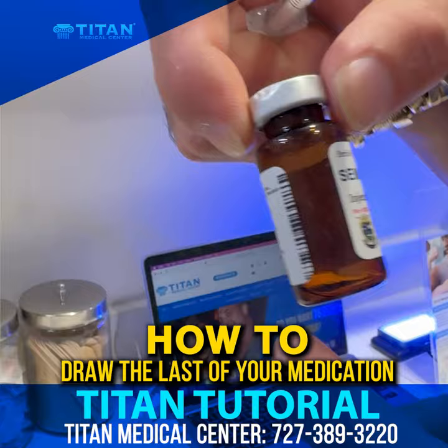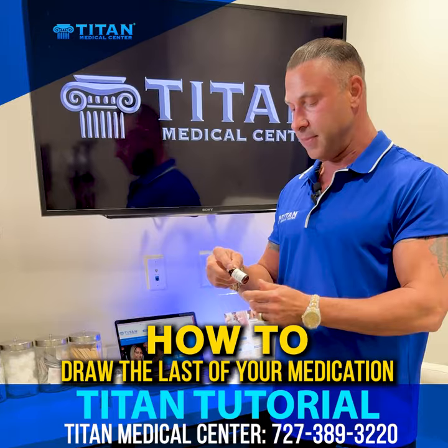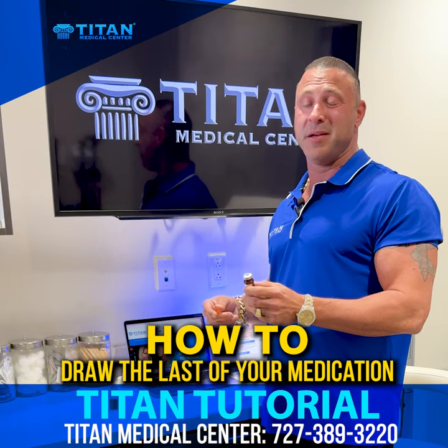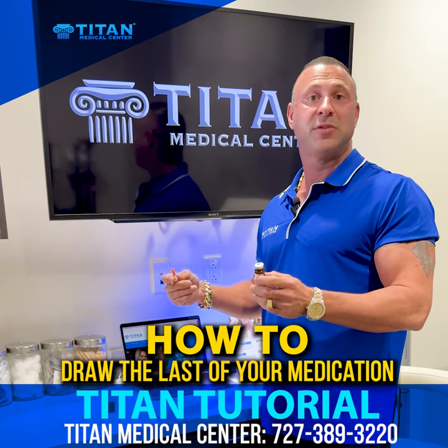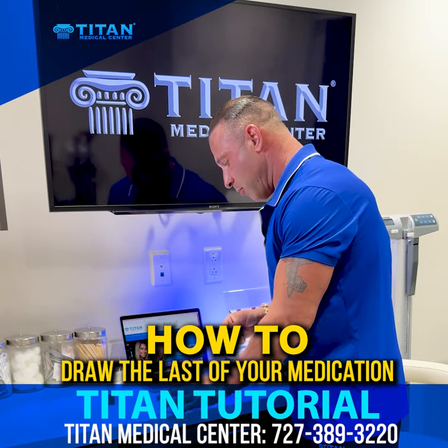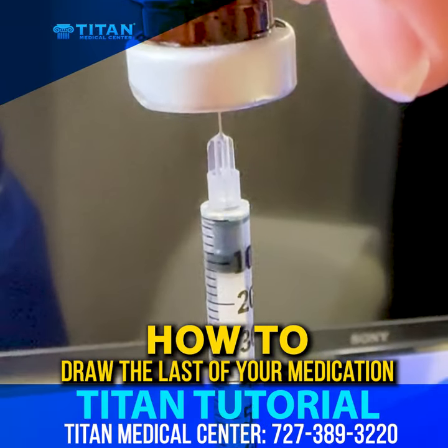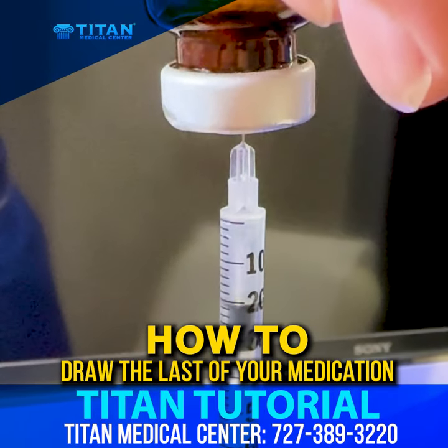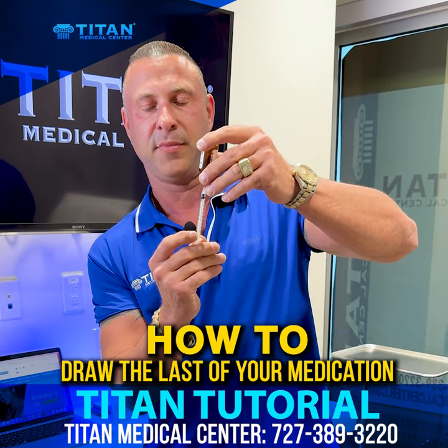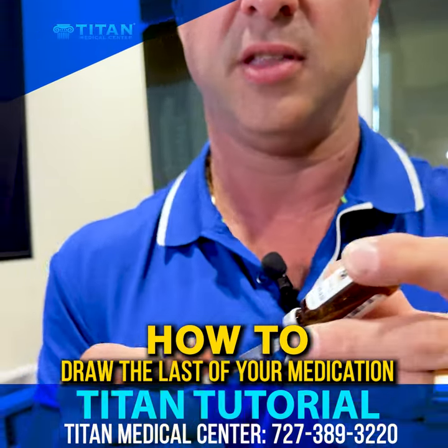Next is real-world use here — semaglutide. There are a lot of patients that take semaglutide and tirzepatide, and a lot of people complain about not being able to get that last little bit. That last little bit might be one or two weeks worth of medication for you, so it's important to get. So at that point, we can go to the side again and pull that medication, going halfway with the needle right at the beginning. You see how it's drawing in — halfway with the needle. That way you get all your medication that you need.